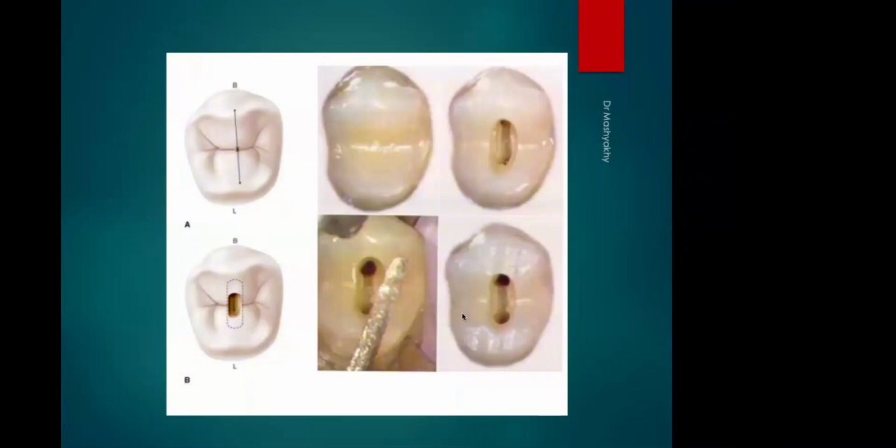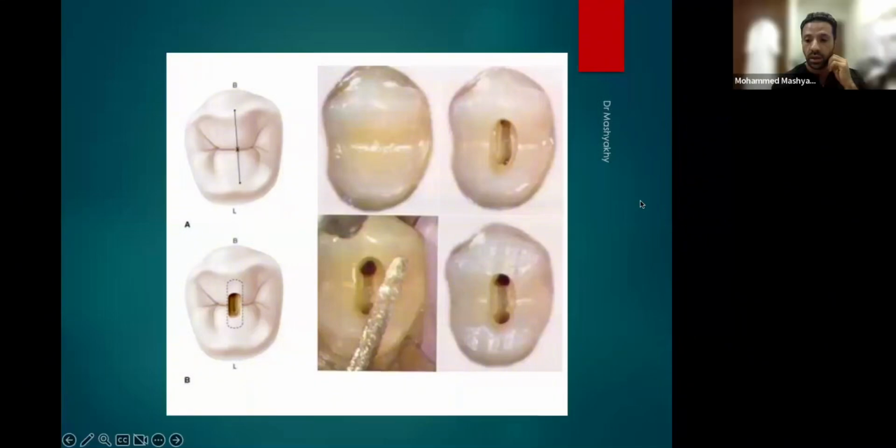Opening a premolar, okay. Opening a premolar should always be conservative, especially if there is no caries. And the opening should be straight in the middle. Don't go past the cusp tip, and you will find the canal easily and beautifully in there.